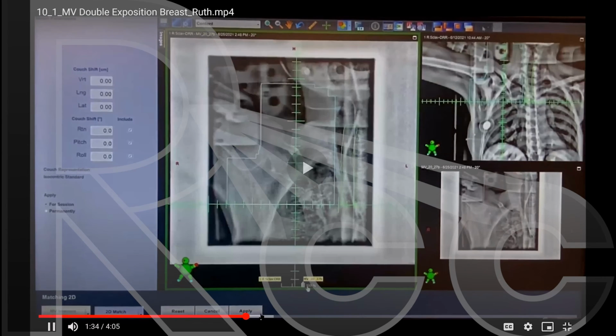Prior to that, they were used, I always called it a hot lamp. I don't know if that's the appropriate name for it, but you can see we're looking in the larger area of the image at the DRR. And then it just kind of shows like a little thumbnail of the treatment image. So you'd run it over and make sure that your bone and soft tissue interfaces are lining up and smooth, that it makes sense visually to you.